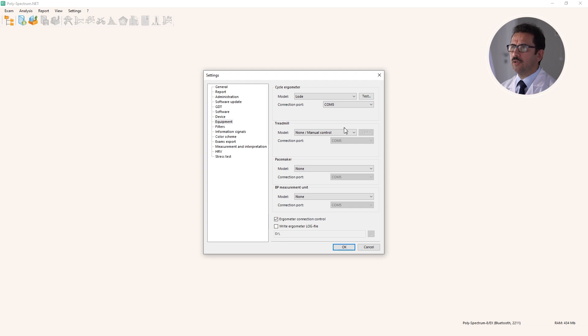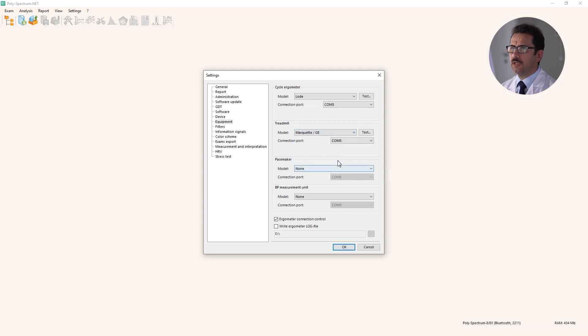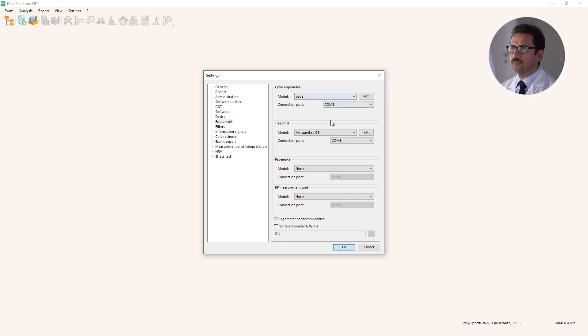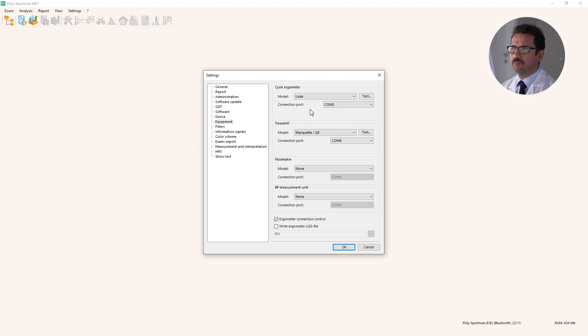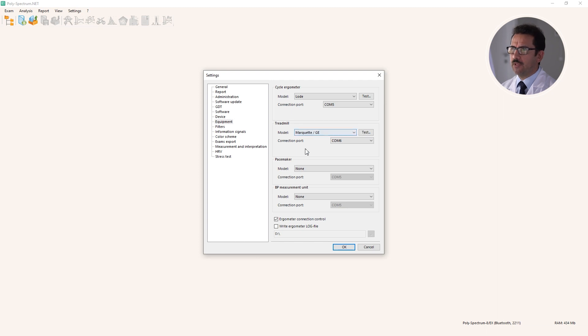You can also select any treadmill if connected. In this case, if you have two devices connected simultaneously, you can on the fly change your plans and perform treadmill or bike ergometry without any problem.